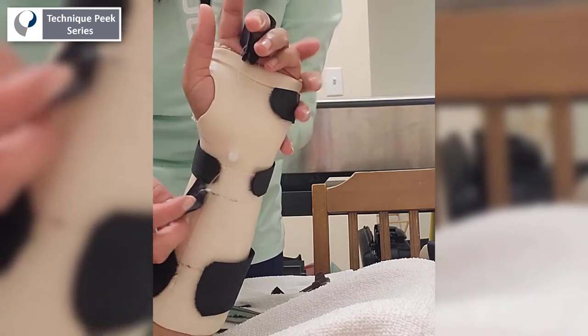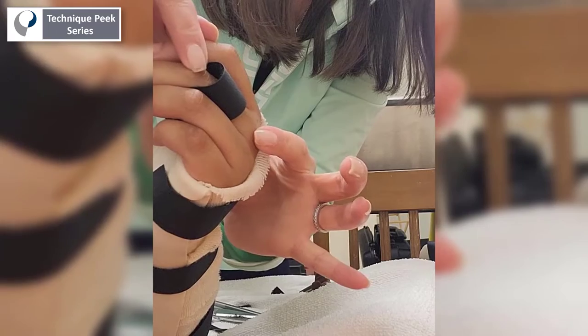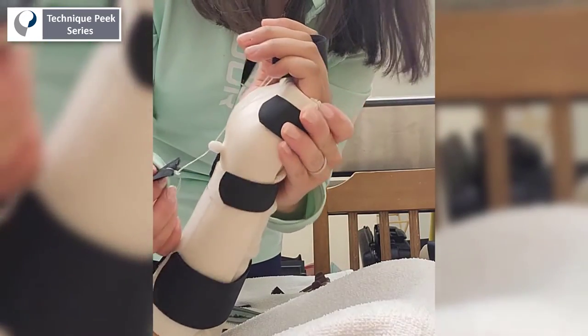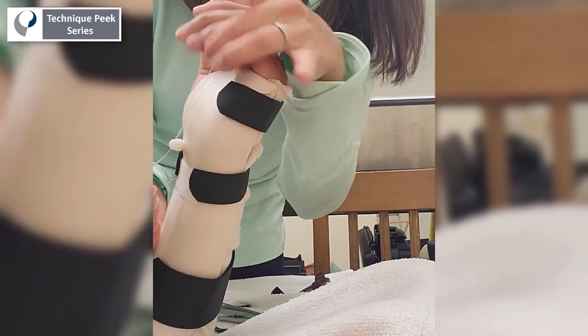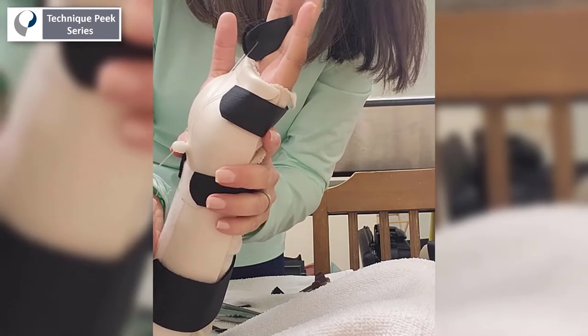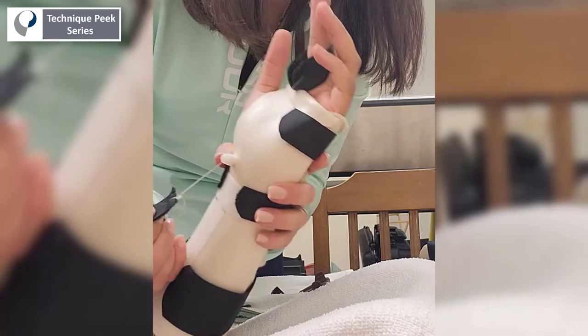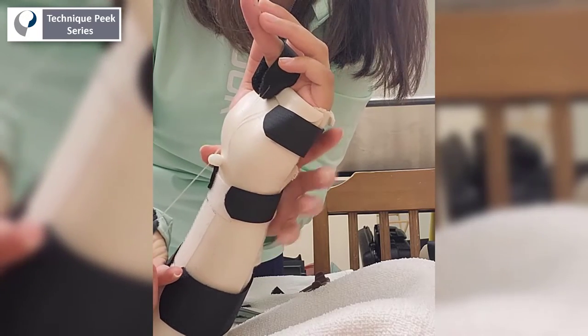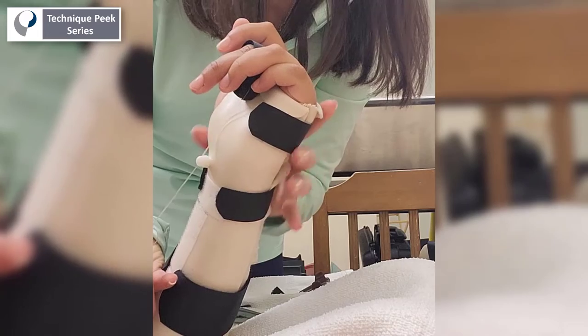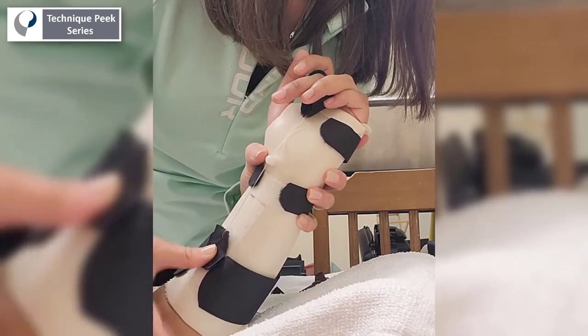When instructing the patient on how to don the splint, make sure they understand to place the finger sling at the proximal phalanx to ensure the correct line of pull. Once in position, they can pull on the proximal end where that loop velcro piece is down through the line guide as they stay relaxed. Once a mild to moderate stretch is achieved, they can secure the proximal end of the strap to the velcro strip.